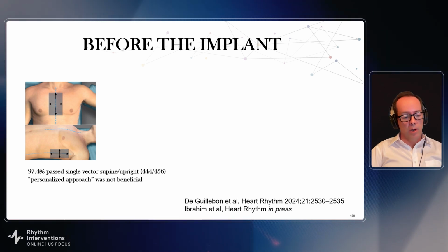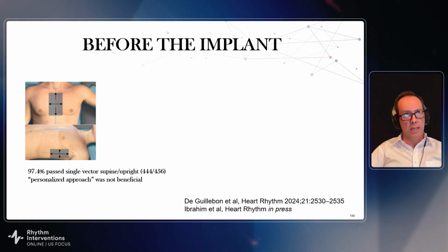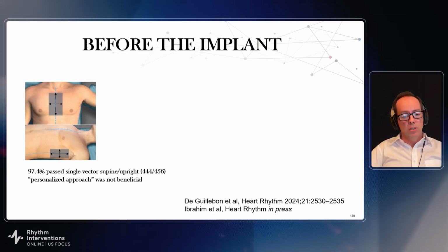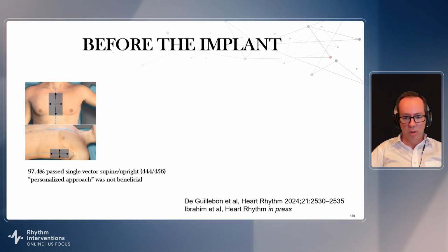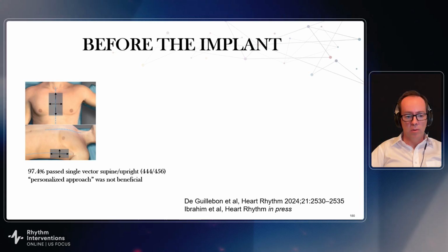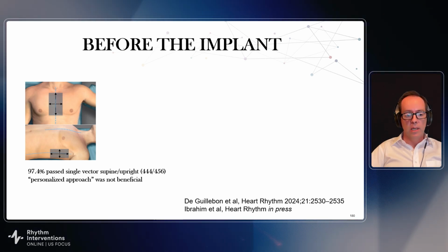I've tried in the past, because this is such a promising device, an important device, especially for some of my young folks, to bend the rules a little bit on screening. But I've learned the hard way that if the patient does not pass a single vector in supine and upright position, they are at gravely increased chance of inappropriate therapy.